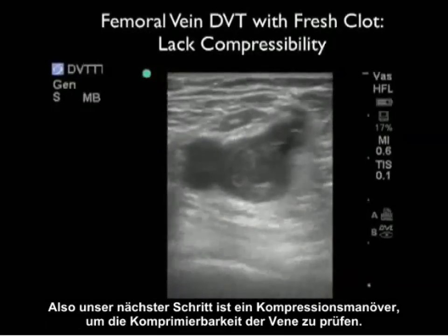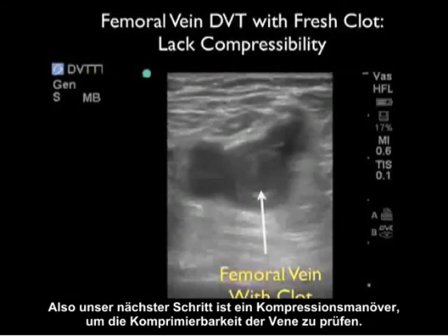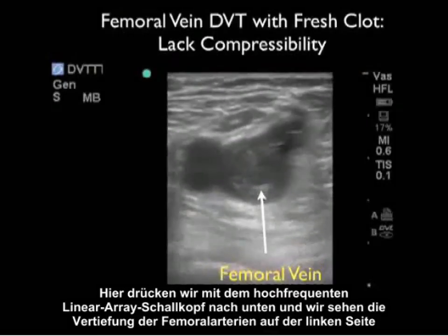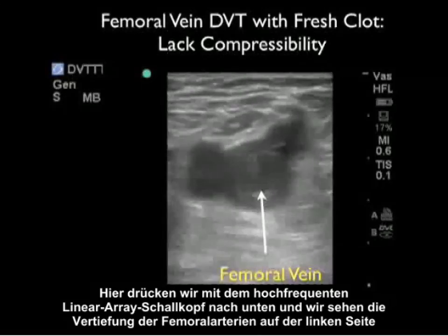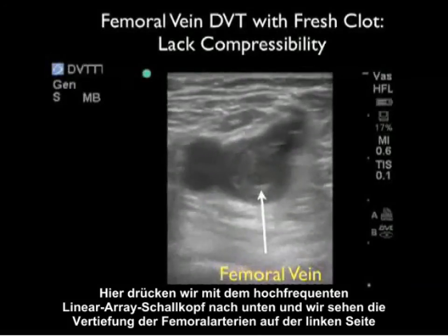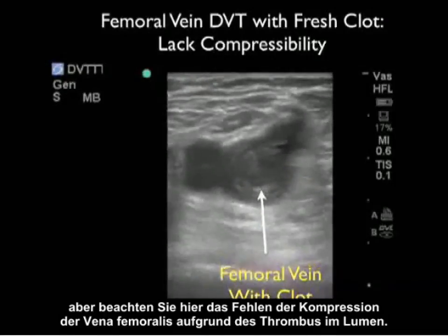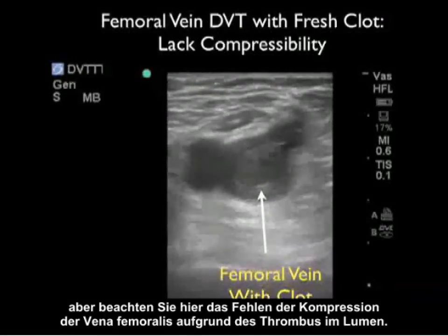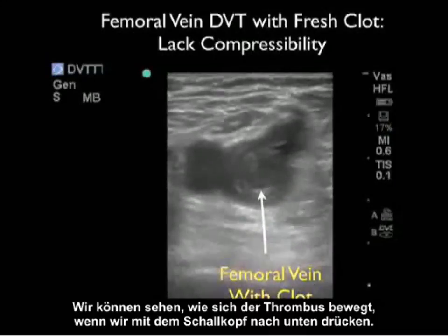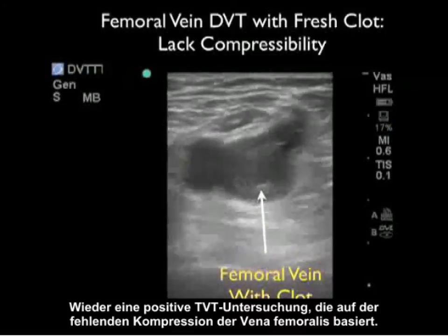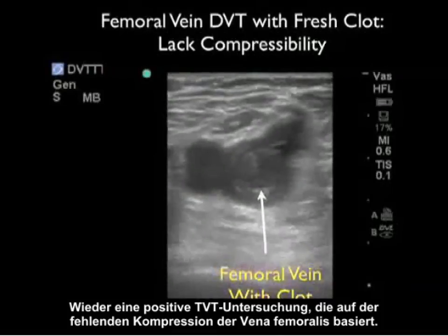Our next move is to apply compression down onto the vessels to look for compressibility of the vein. Here we're compressing down with a high-frequency linear array probe, and we can see indentation of the femoral arteries towards the left, but note the failure of compression of the femoral vein due to the presence of thrombus within the lumen. We can see the thrombus moving around as we press down with the probe — a positive DVT exam based on failure of compression of the femoral vein.